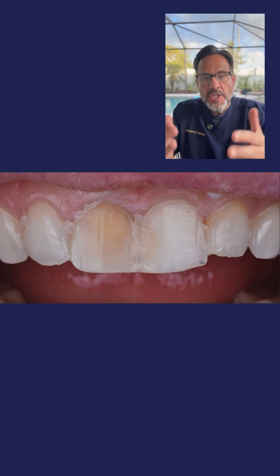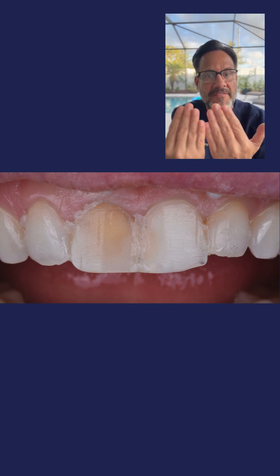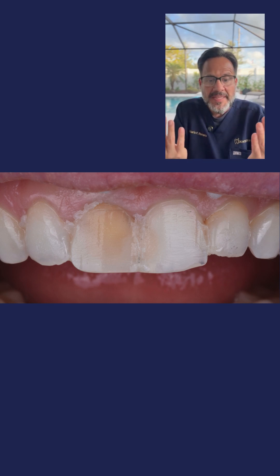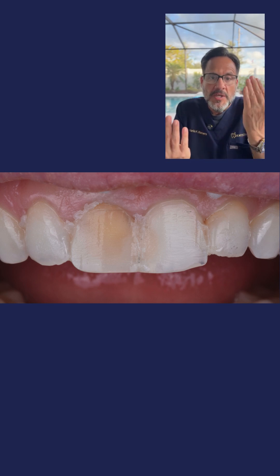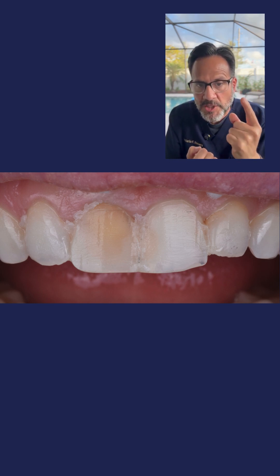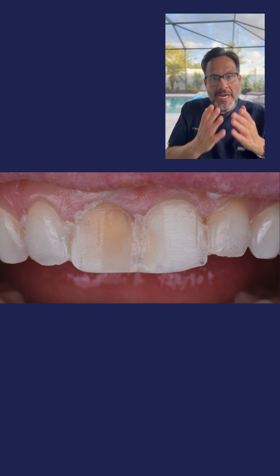So let's go to photo number four. In photo number four, you are seeing now that I have made all these horizontal lines come together. I have flattened them down using a diamond burr, and you can also appreciate that I have reduced more on the facial of tooth number eight compared to tooth number nine. Tooth number eight is the dark tooth, the one that I want to really be able to mask with my ceramic restoration.